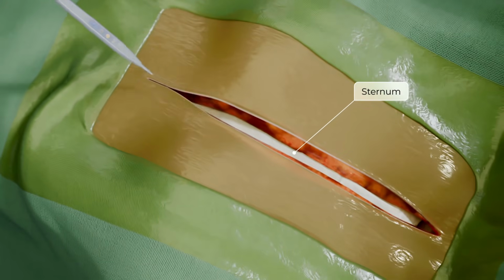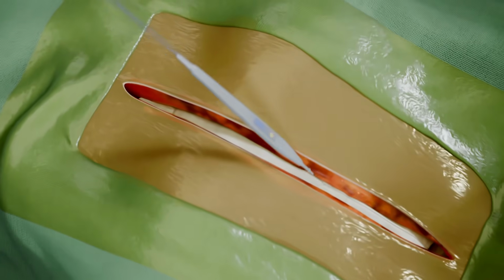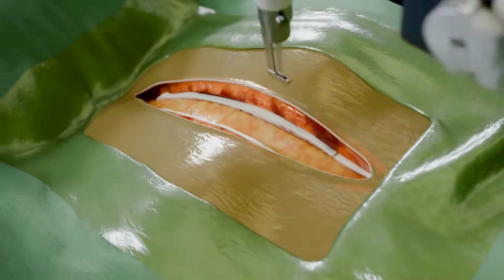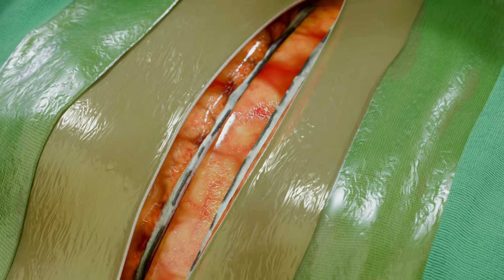Once symptoms appear, surgical aortic valve replacement becomes necessary. In this video, we will demonstrate step-by-step aortic valve replacement using the Ozaki procedure. Modern cardiac surgery employs various approaches, including minimally invasive options, thoracotomy, mini-sternotomy, but in many cases optimal access to the heart is achieved through a conventional median sternotomy, a vertical incision through the sternum.